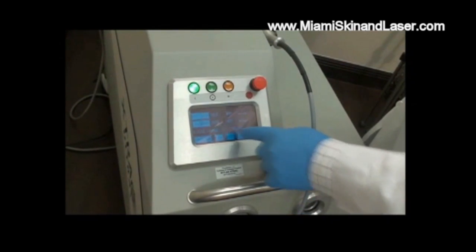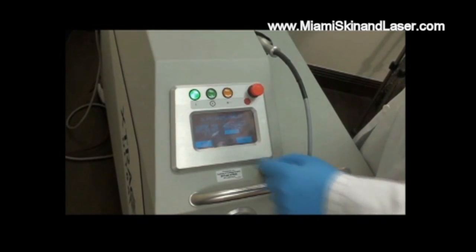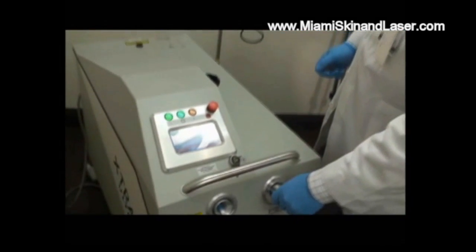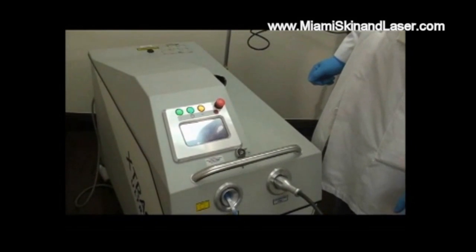We're going to increase the energy by five percent and go ahead and continue. Calibration is required in order to calibrate the machine — let's place it into the handpiece here. This is the process of calibration.